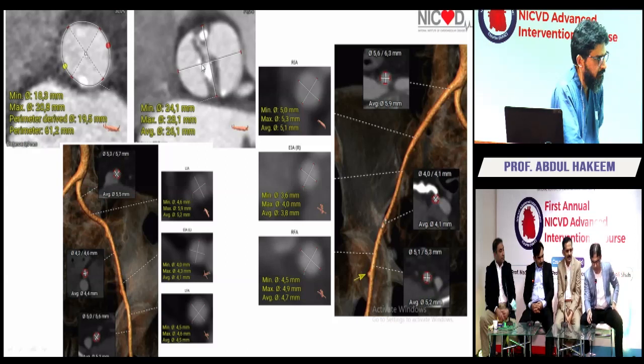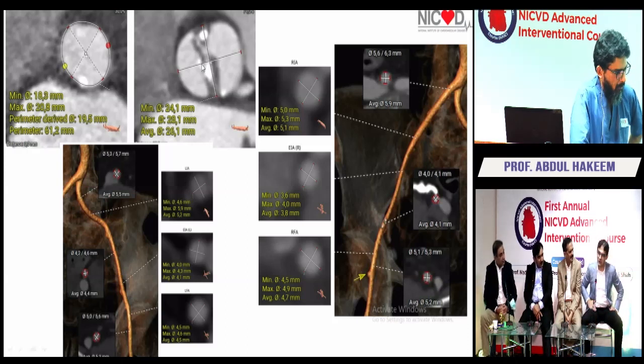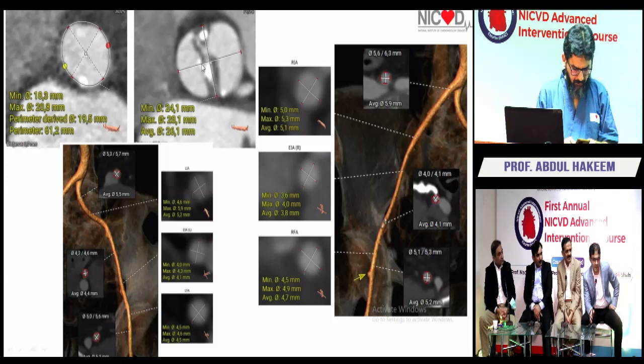We have to, depending on, again, the center. At the Cleveland Clinic, they do all the sheaths in one groin, right? But normal, like standard is that we prep both the groins. On one groin, what we do is that we get venous access, put our temporary pacer in just in case. And also through that, if we have to cross our pigtail into it, we get that access, put a 6 French sheath. The groin that we decide where we see there's not a lot of angulation or calcium, that's the site we should choose for our bigger sheath.